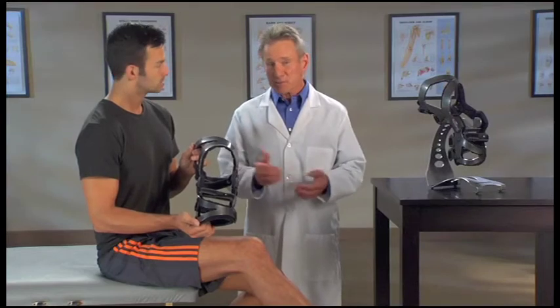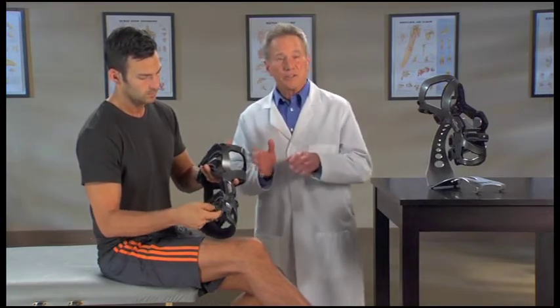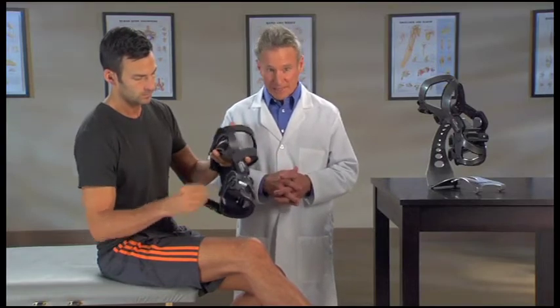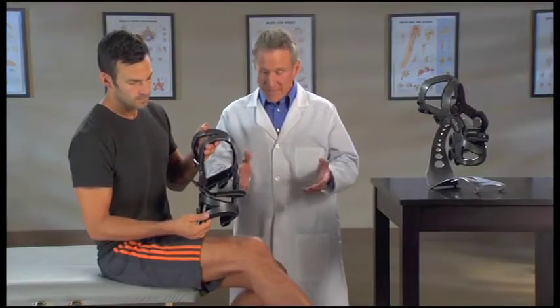The LPR knee brace is easy to put on. Start by unfastening all the straps except for strap number three, which can just be loosened. Folding the hook loop tabs back against the straps will stop the straps from getting tangled. Sit with your knee bent at a 30 degree angle in a gas pedal position.